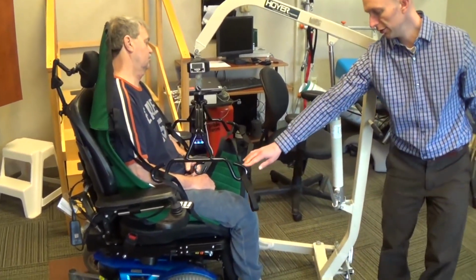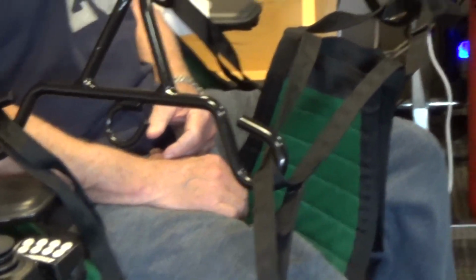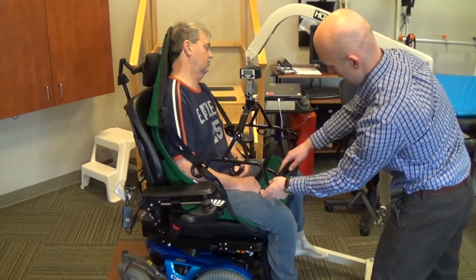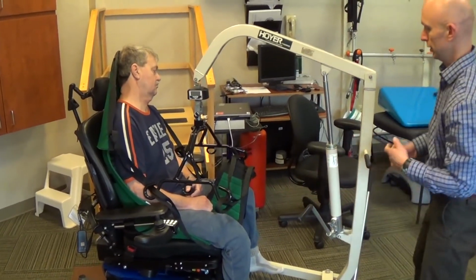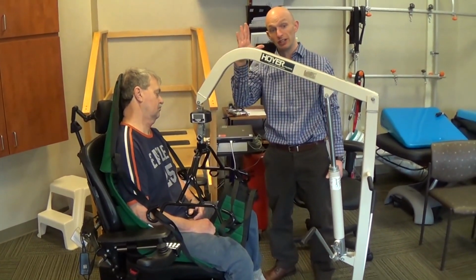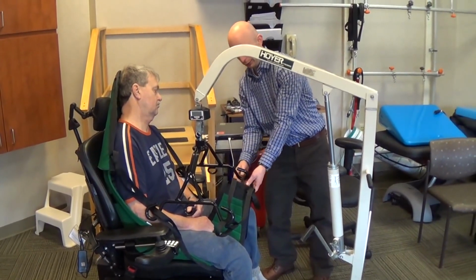If you can see here, this position, with the closest loop in, would have the person sitting in a more upright position. So we're going to lay back in bed, and they need to be flatter. We can go to the most outside loop. Or if someone's unable to tolerate being more at a 90-degree angle with their hips, you can also put it in the furthest loop out.